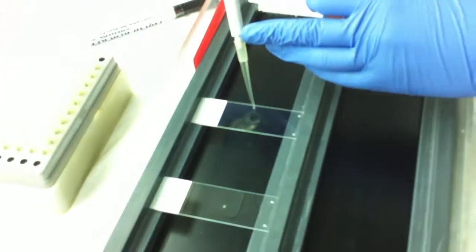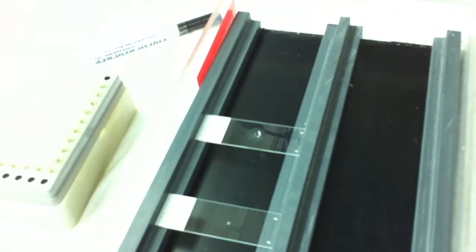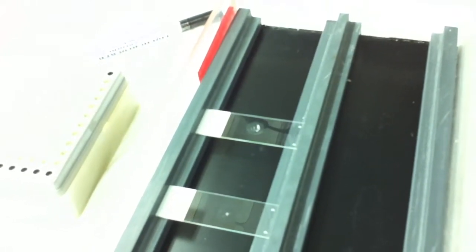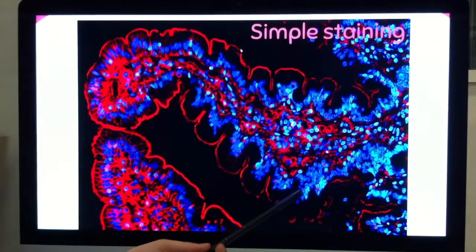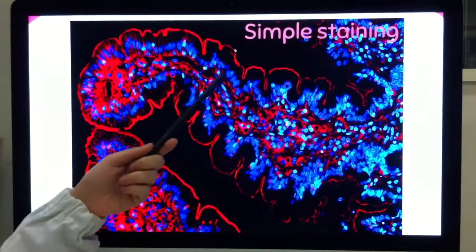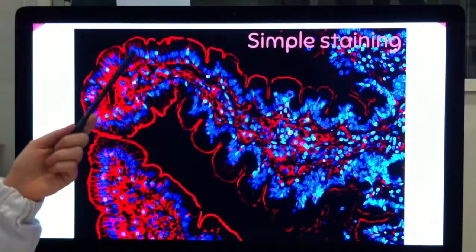After the incubation of the primary and secondary antibody, we will perform a counterstaining with DAPI to better analyze the structure of the tissue. Then it's ready for the microscope. Once at the microscope, we can see in blue the DAPI staining for all the nuclei of the tissue, and in this case in red a structural protein, which is beta-actin, staining the apical part of the enterocytes.